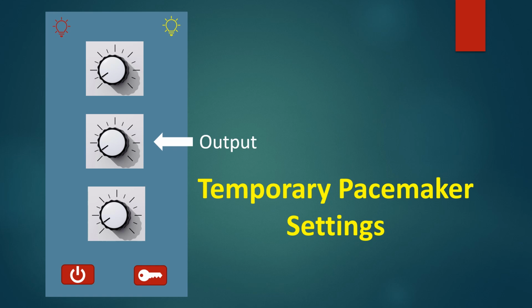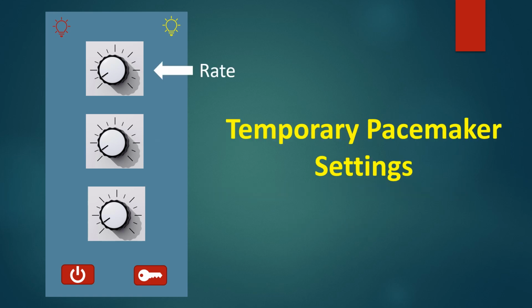While checking for threshold, sometimes the presence of spontaneous rhythm may be detected. Otherwise, we can check for spontaneous rhythm by gradually reducing the pacing rate. Once sinus rhythm with fair rate is detected, keep the pacing rate at a lower backup rate for emergency. It is customary to observe for one more day before removing the temporary pacing lead, but this may vary depending on the stability of the spontaneous rhythm.